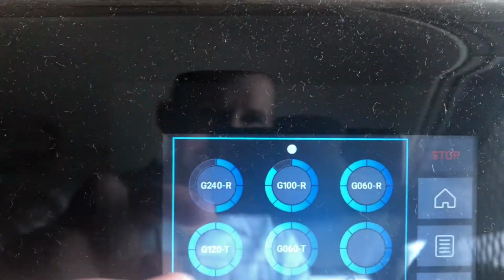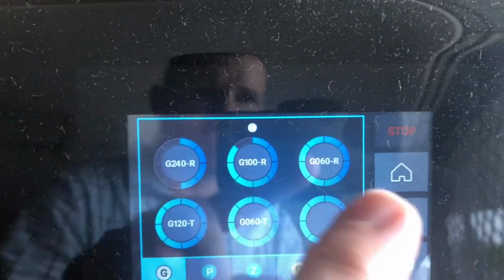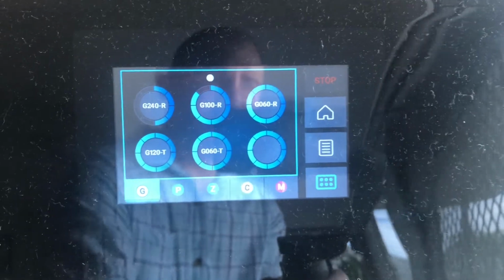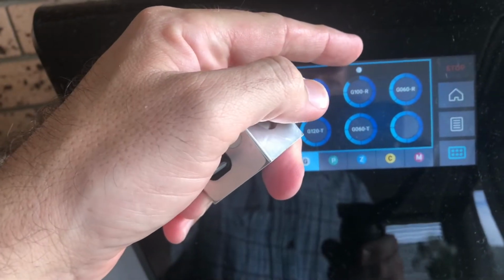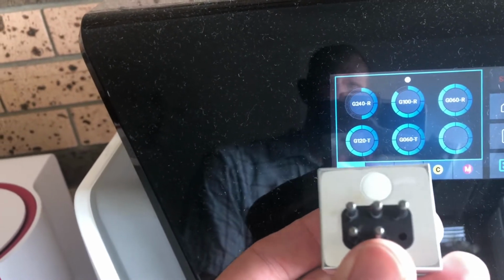Now there's a countdown of every single burr. So if your burr starts to wear out, it starts off as full blue like that, and as you use it, your burr starts to wear out. Now you can notice that your tools, you've got the color at the top, and on the screen you've got your color on the top just up there. So this is a position. Each one of those 5 burrs that are there are these 5 burrs on here.